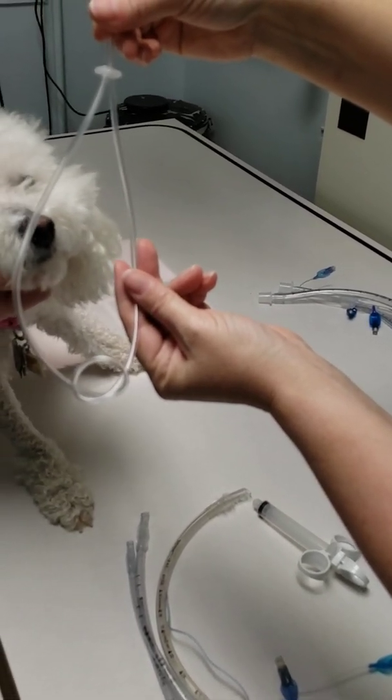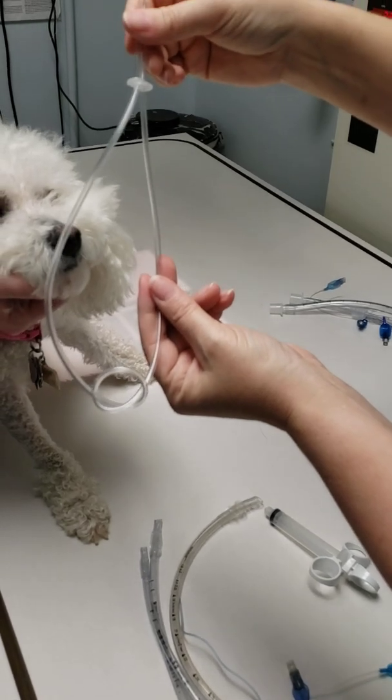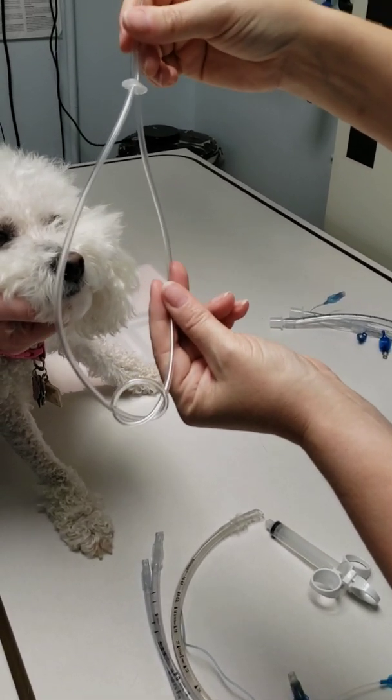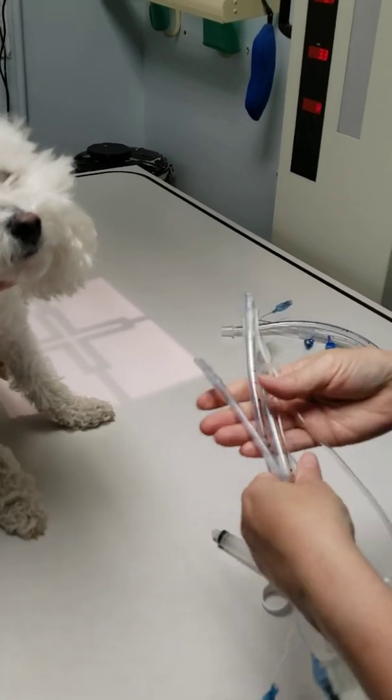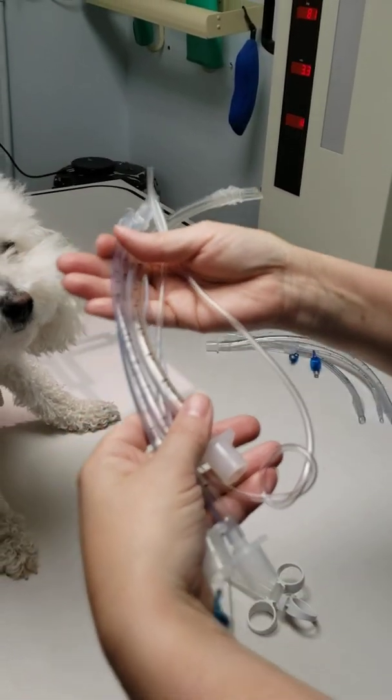So that's how you select a tube, how you check the tube, and how you prepare to tie the tube into the dog's mouth. Now I can have this already on top of the chart, and when it's this patient's turn, I'm already prepared.